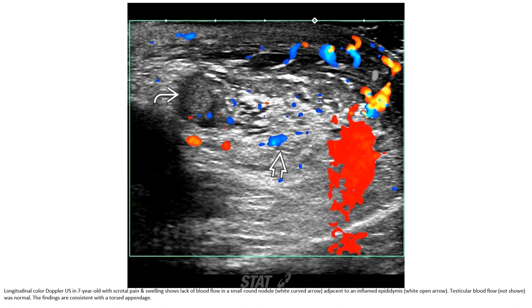This is the case of a seven-year-old with scrotal pain and swelling. Ultrasound shows lack of blood flow in a small round nodule adjacent to the epididymis. Testicular blood flow was normal. The findings are consistent with torsion of the appendix testis.